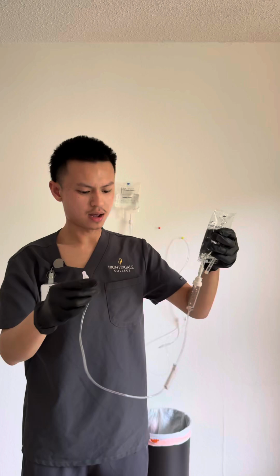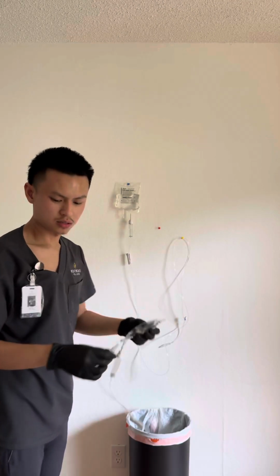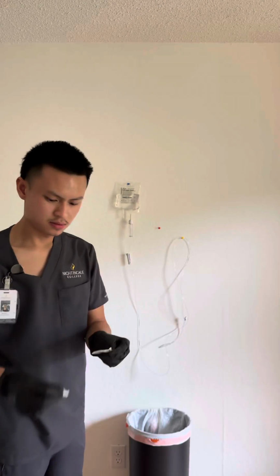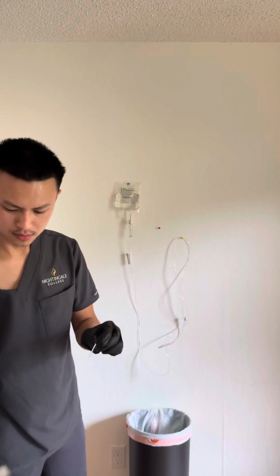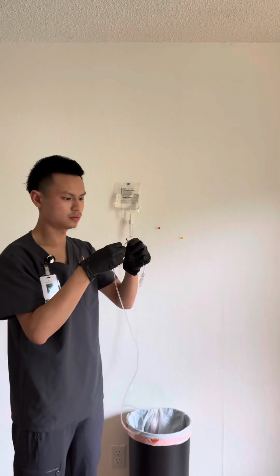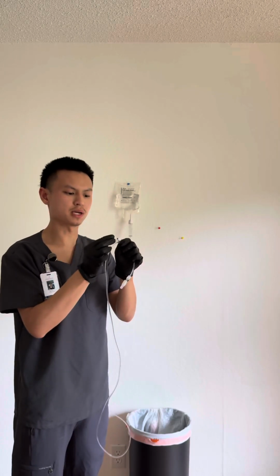Now I will get my alcohol pad, and I will clean the Y site so that the secondary tubing can connect to it.